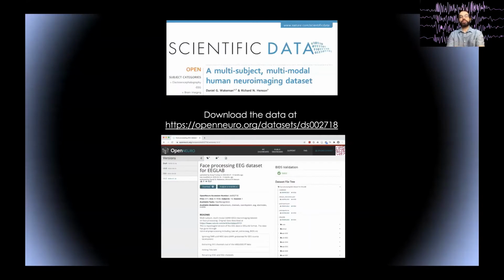So I'm also going to use some data when I do the demo on NSG, and I'm going to use some data from OpenNeuro. So OpenNeuro is a platform, and it was originally designed in 2016 mostly for fMRI and MRI data, and now it's been opened to the EEG community. We also got a grant from NIH to develop a platform specifically for EEG based on OpenNeuro. It's called NEMAR.